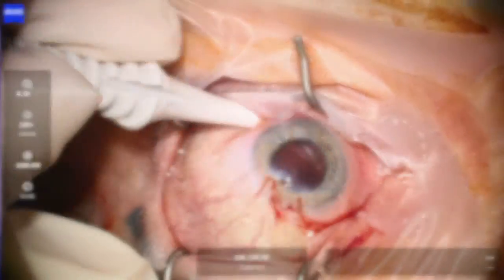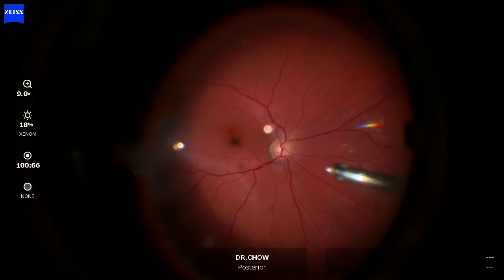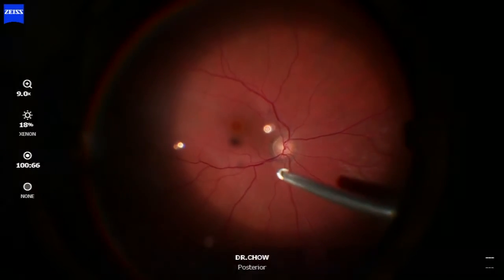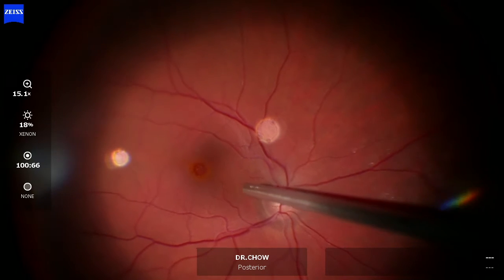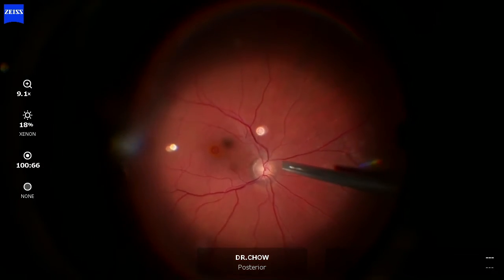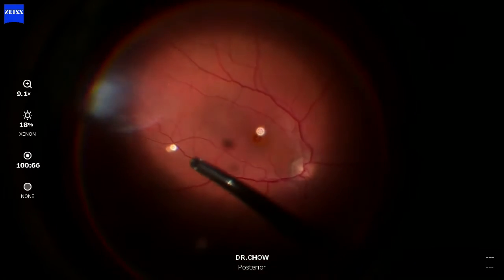After an uneventful cataract surgery, 23-gauge cannulas are placed and core vitrectomy started in standard fashion. Since the beginning of the case, it seemed that there was a complete PVD. Nevertheless, we rechecked by doing high vacuum around the optic nerve and arcades.